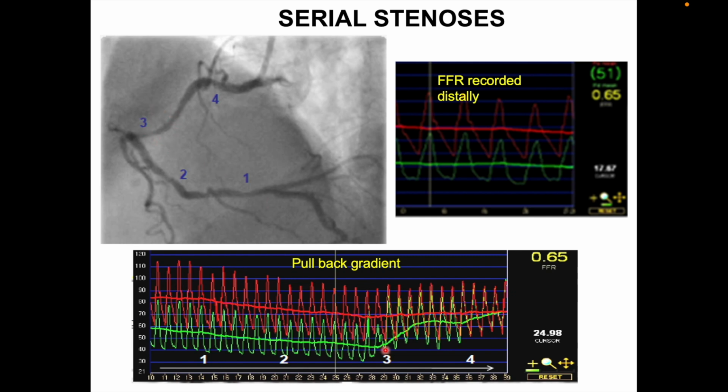And how big is the step up gradient? So you have to see the lower point and the higher point and correspond them to the pressure measurements here. So this at 3, the lower point corresponds to maybe somewhere 40, somewhere 40 pressures, and here the upper point over here, this corresponds to 60.